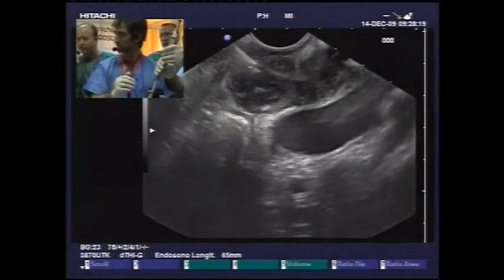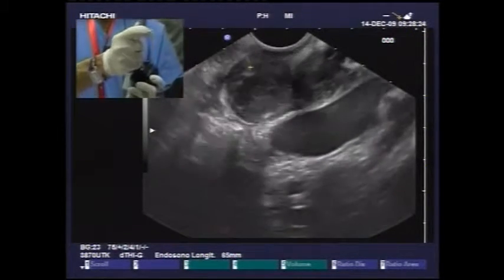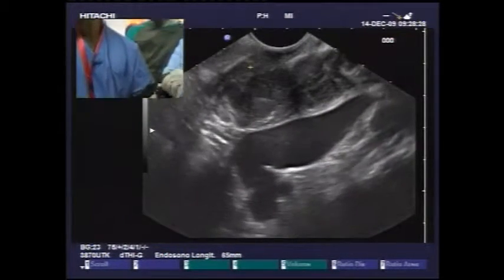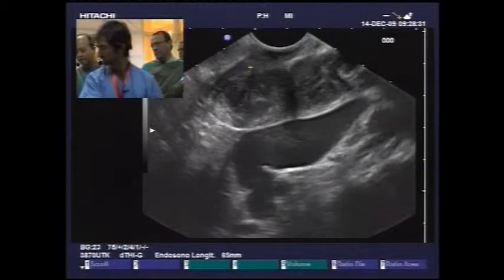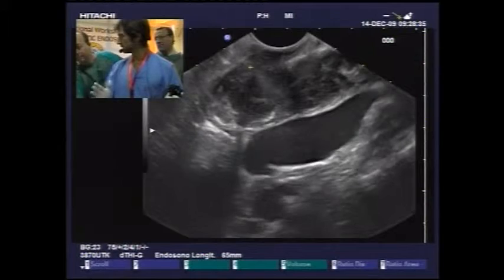Then I close the vacuum to avoid bringing more debris into the syringe. And then I'm out. That's a very nice technique. You only do it once? Pardon? You only do it once, and you don't shimmy forward? No, because we are using a big needle.